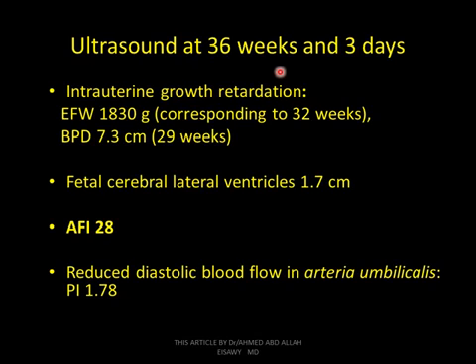Ultrasound seen at 36 weeks and 3 days. Intrauterine IUGR and fetal cerebral lateral ventricles 1.7 centimeter. Amniotic fluid index 28. Reduced diastolic blood flow in the umbilical artery, 1.78. This is the pulsatility index.